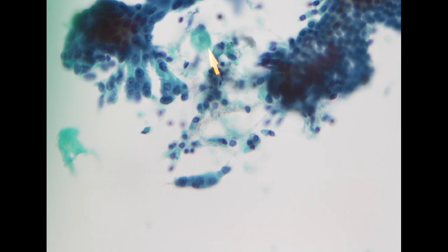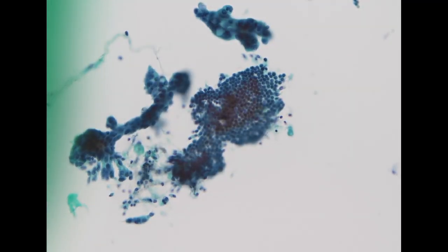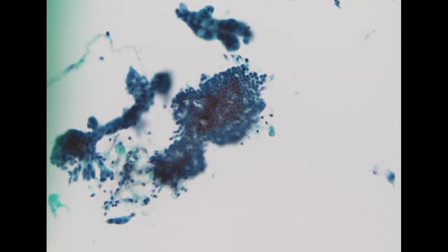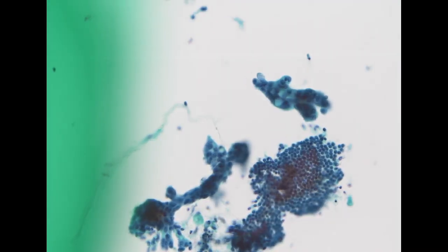Here, we see a very scant necrotic pattern over here. Okay. The concurrent biopsy specimen was already diagnosed with adenocarcinoma. But in these cytology specimens, I find that the cellularity is not enough, and the nuclear feature is not unequivocal. So I decided just to call these suspicious for adenocarcinoma. But overall, I think the pattern is highly suspicious for adenocarcinoma. If we have more cells... so this one I call suspicious.